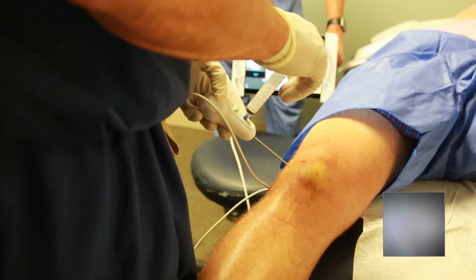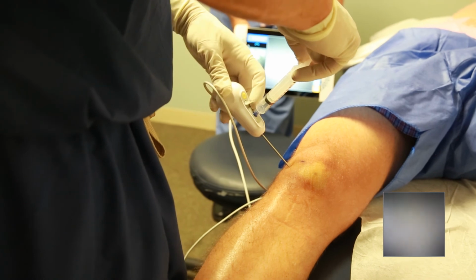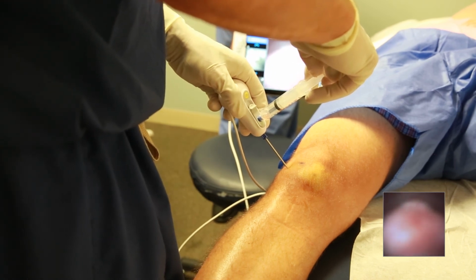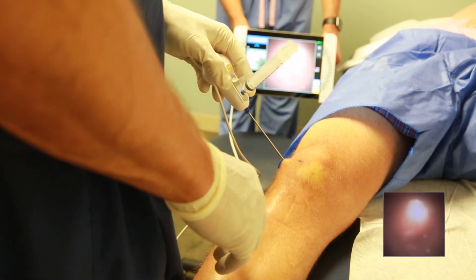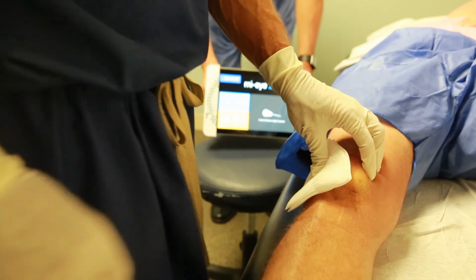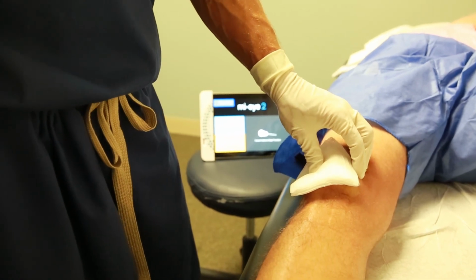When we're done, what I like to do is suck as much water as I can out, and sometimes you can get more and sometimes you can't. Sometimes it's easier to suck water out with the scope pulled back, and then once you finish, we just pull out. He's going to drain a little bit, and you can see he had no pain. We probably were in there 5 or 6 minutes. He did fine, and we got what we needed to do.